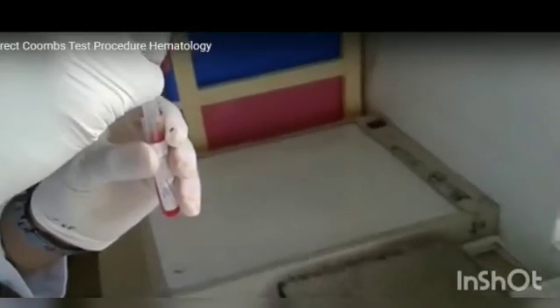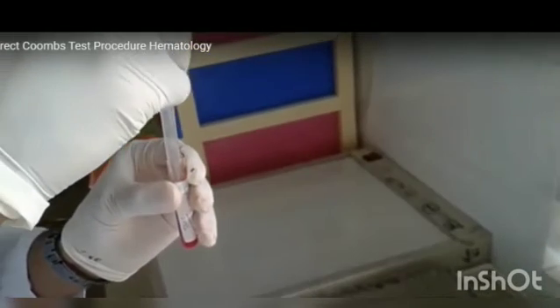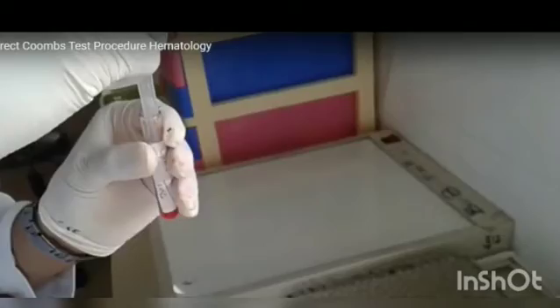After that, you will put 1 drop of the red cell suspension that you have made. Mix it properly before adding the blood sample. Add it carefully.